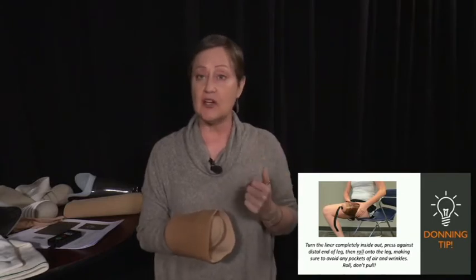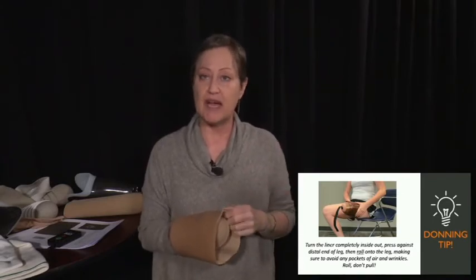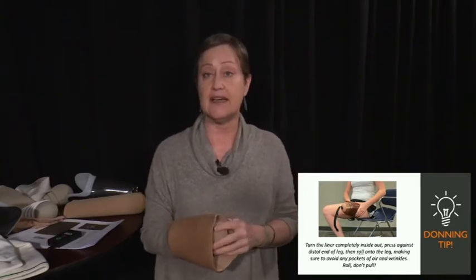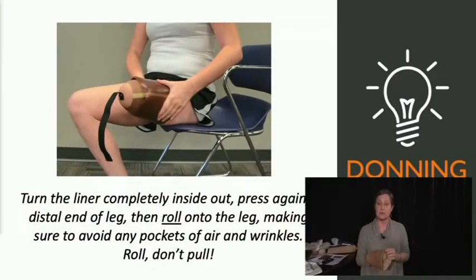How far the liner comes up the leg is obviously dependent on the patient, how long their residual limb is, what kind of suspension system they have. You might find that you're spending an entire therapy session with donning. So remember that patients need to have good sitting balance to be able to lean over, especially trans-tib patients. They need to reach kind of far to roll these liners on.